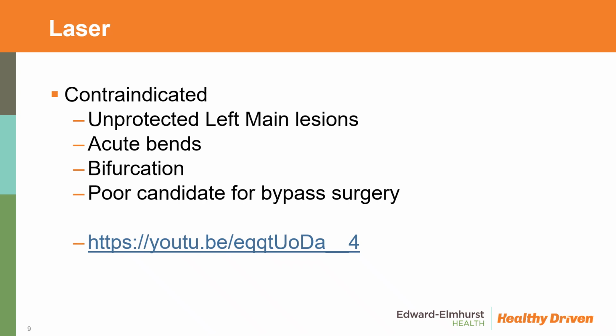It is contraindicated in unprotected left main lesions, acute bends, bifurcations, and if they're a poor candidate for bypass surgery. And then below, I'll let you look, I'll put it in the comments, this little link, just kind of a quick overview of laser from their website itself.